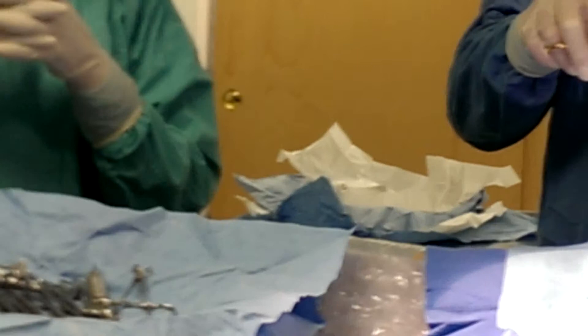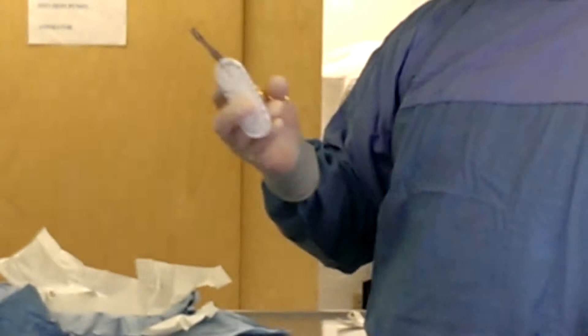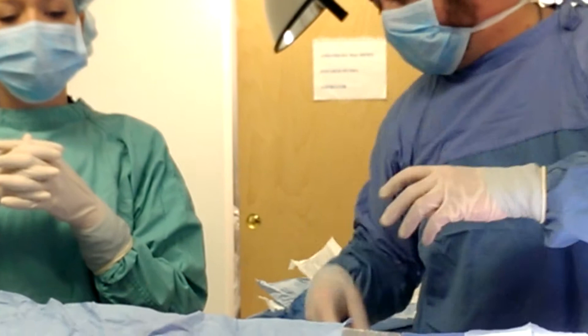Before I ever make my first decision, this is personal, but I always have my suture ready first. If I make a decision and hit a monster bleeder, I don't want you to scramble for your suture while I'm trying to pinch it off. Her respiration's good.